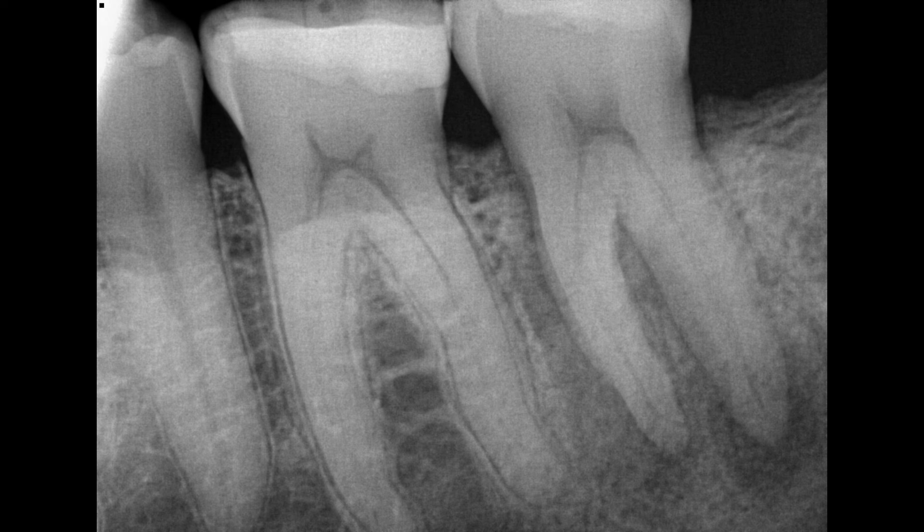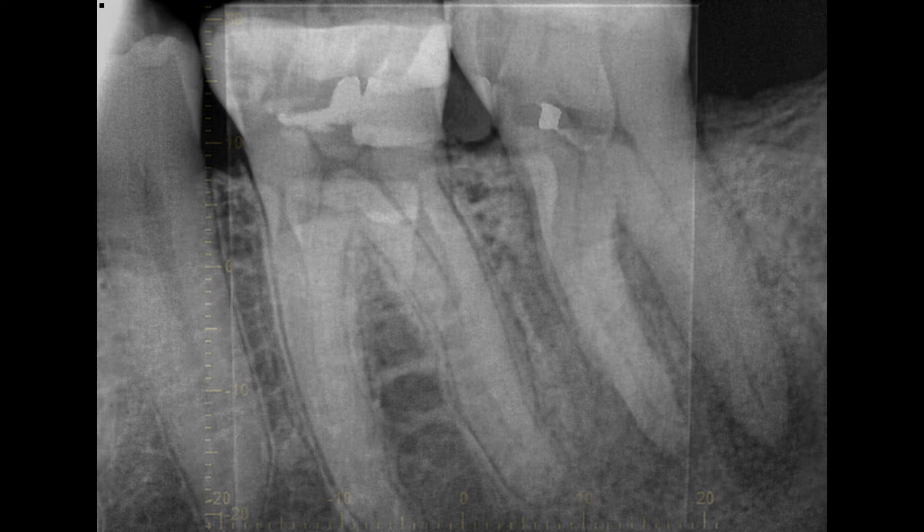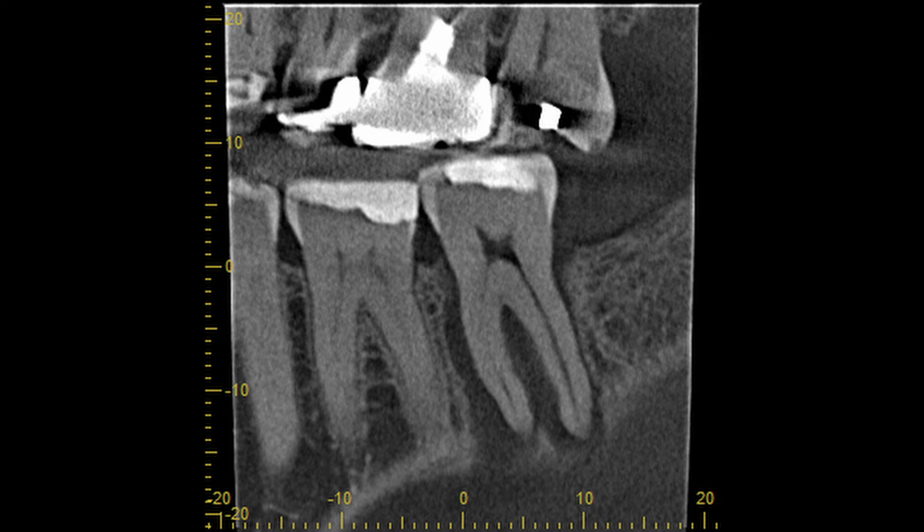You look at the PA here, you can see there's some infection and some bone loss. You look at the sagittal view of the CBCT, you can see there's massive bone loss, suspecting a fracture.